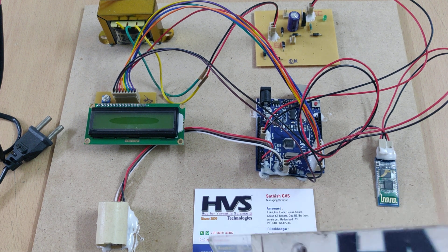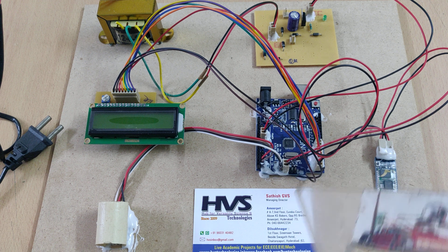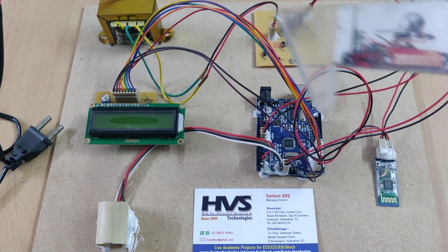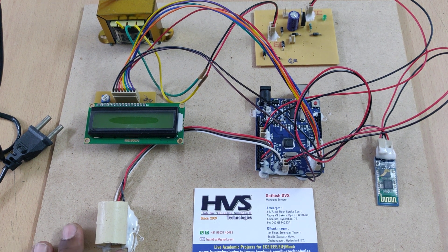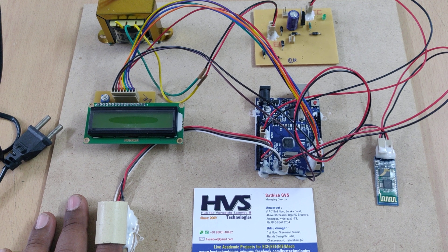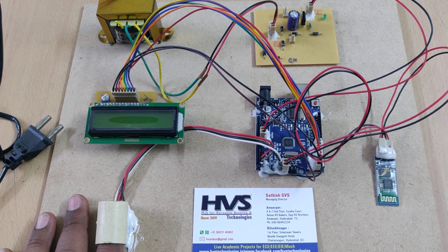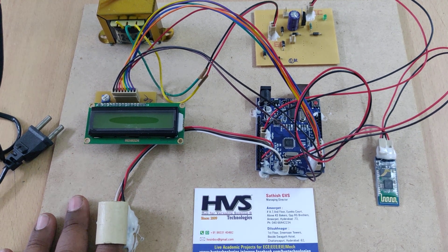This 5V supply is used to run all input and output modules, along with the Arduino and LCD display. Once the 5V power supply is on, the data LED lights up. Whenever a finger is placed inside the sensor, the photodiode receives the light emitted, and based on the received value we calculate the approximate glucose level in the blood.